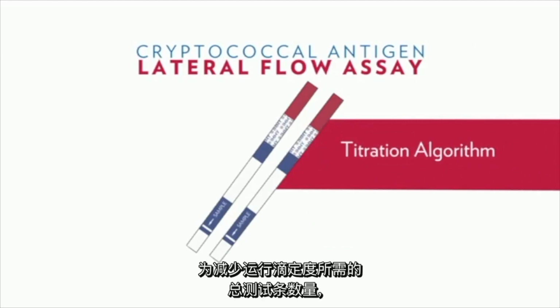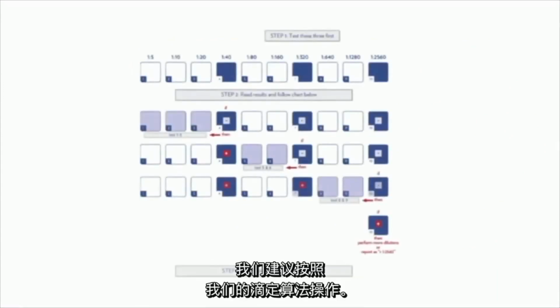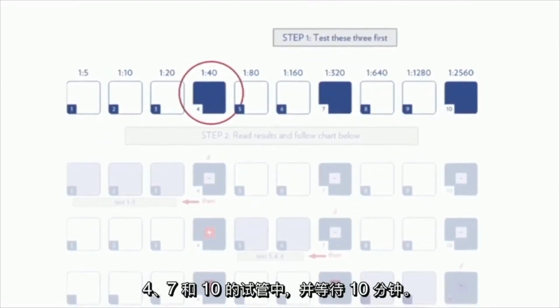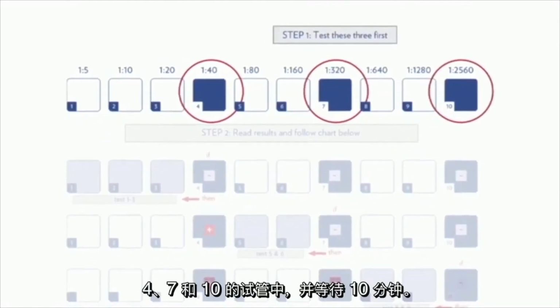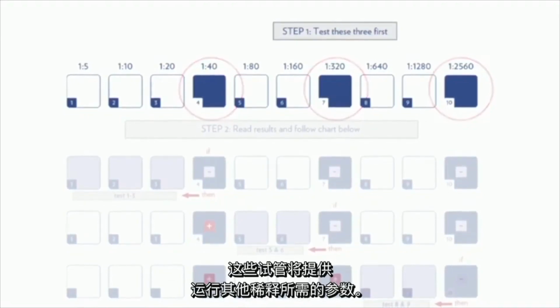To reduce the total number of strips required for running the titer, we recommend following our titration algorithm. Begin by placing test strips in the tubes numbered 4, 7, and 10 and wait 10 minutes. These tubes will provide parameters for running the remaining dilutions.